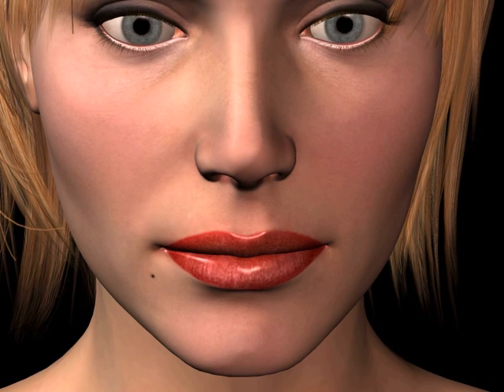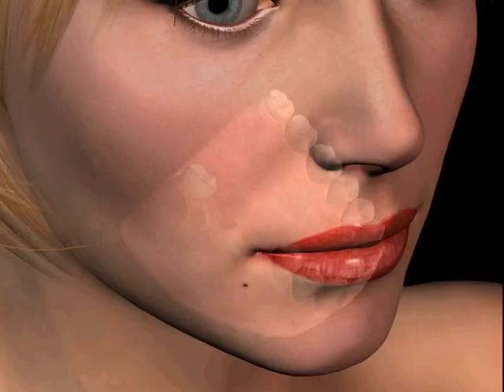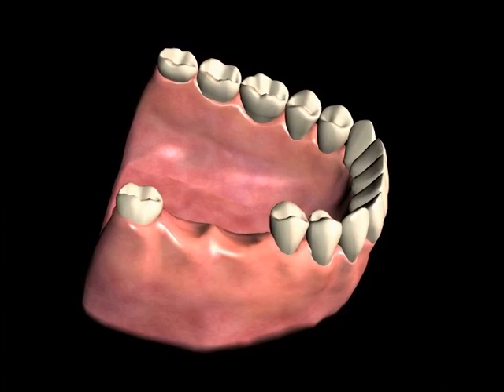In areas having tooth loss, if the neighboring teeth have adequate bone support, an option for replacing the missing teeth can include a fixed tooth-supported bridge. This is a non-removable method of attaching replacement teeth to the natural teeth.